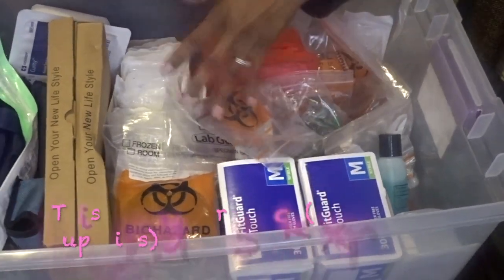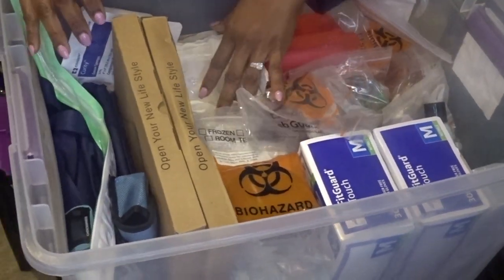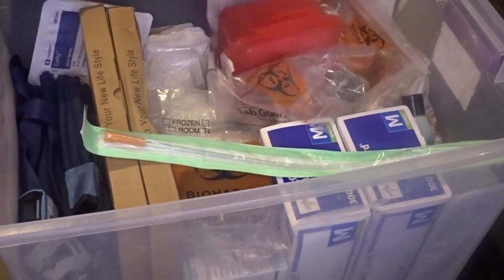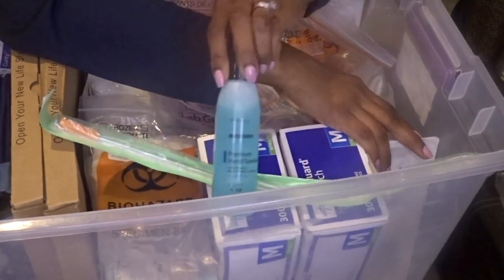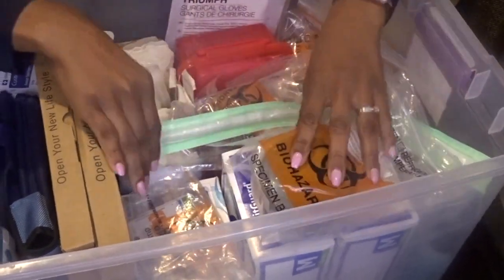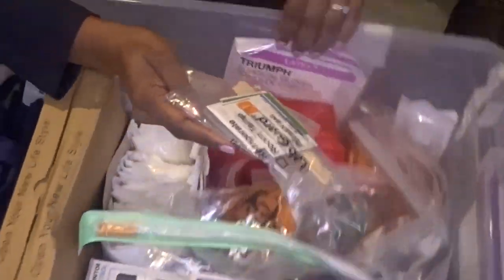All of this is provided by the company I work for. We do have to charge patients for everything we take out of our car stock. I also have a Foley, a pack of sterile gloves, a Foley insertion tray, a bottle of hand sanitizer, gloves, stool collection cups, and occult blood swabs.